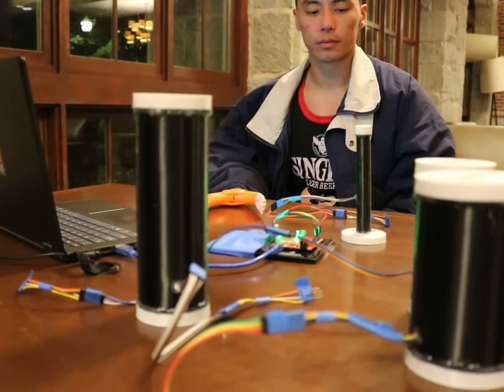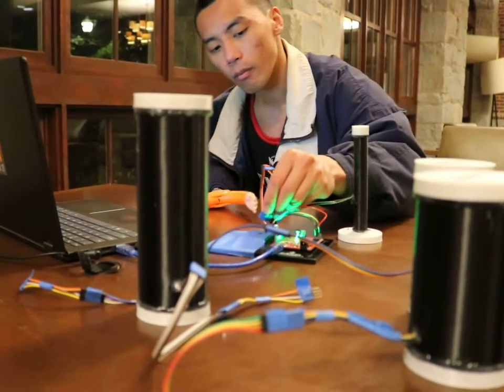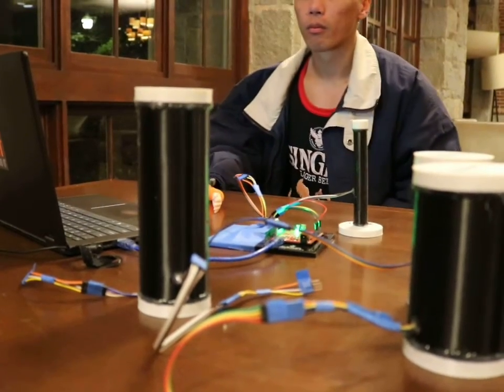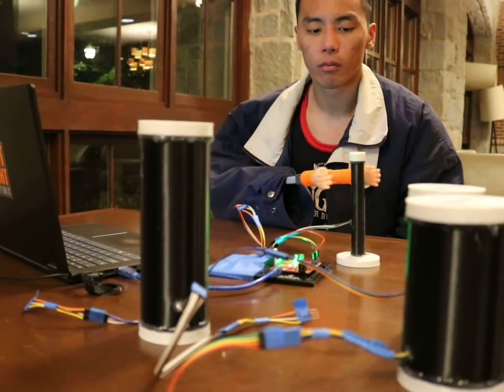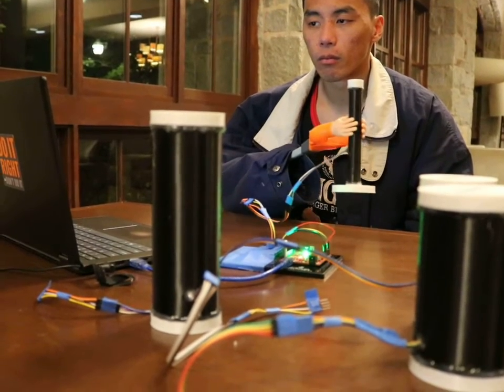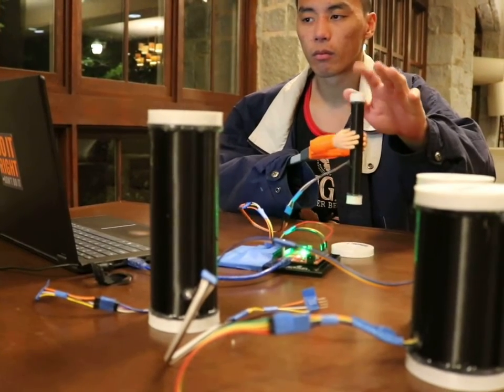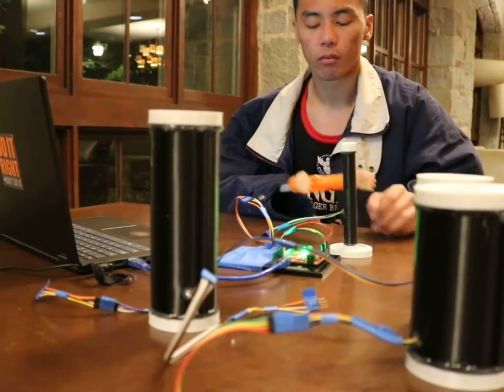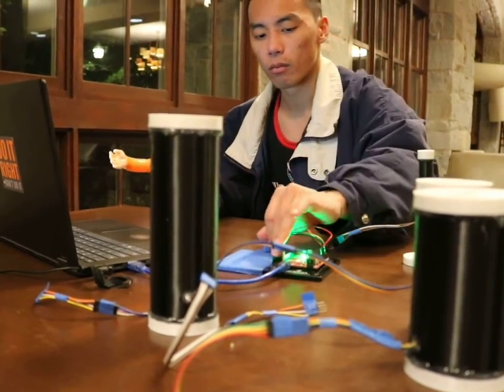The materials used in order to create the Gripology toolkit were cheap and relatively easy to find. The cylinders were 3D printed using a flexible filament called TPU, and the internal sensor that is placed inside the cylinder is a barometric pressure sensor that is connected to Arduino, which is then connected to a processing sketch.